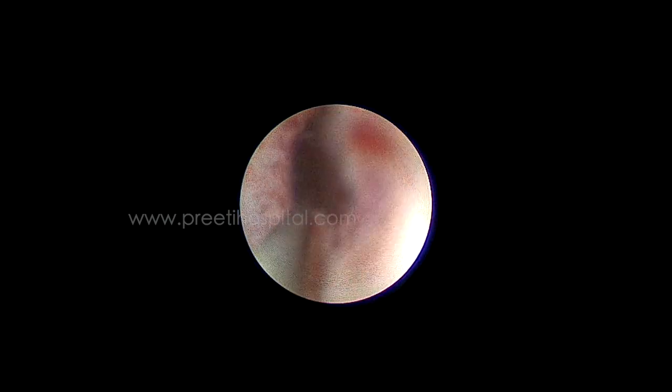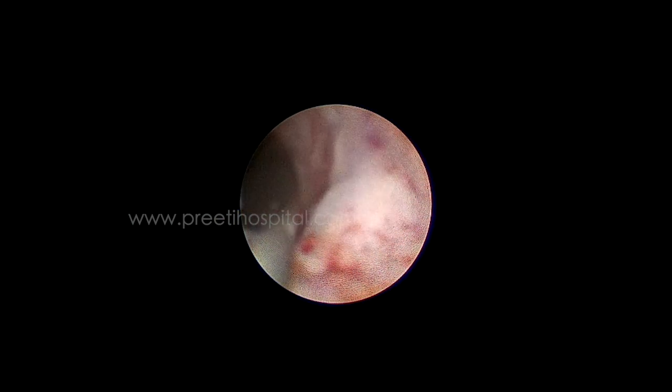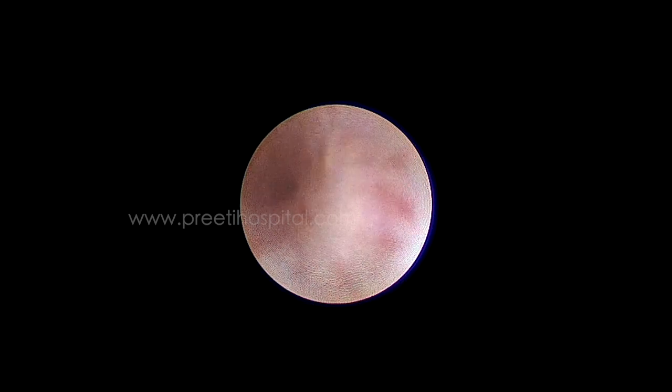The ureter is becoming a little red, which clearly shows that it is very tight. This is an unedited video of five minutes. By this time the stone has already gone up, which means you do not have a choice to do RIRS. In this case, if you do RIRS, stricture of the ureter can occur even without using the laser. That is why pass a stent and come out.